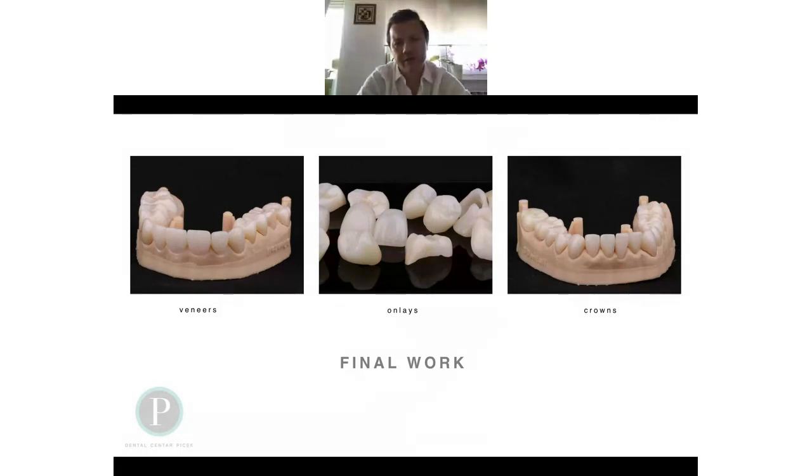There is a wax disc, and this case was done this way. Our dental technician, after they receive the scan, does the whole design and mills the wax. This is the wax disc, like a PMMA disc. It looks almost the same.